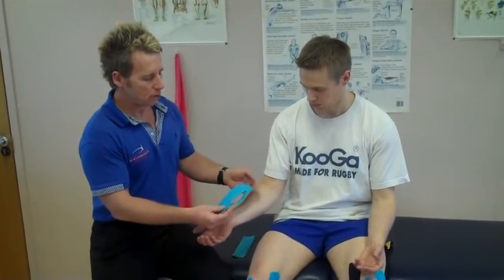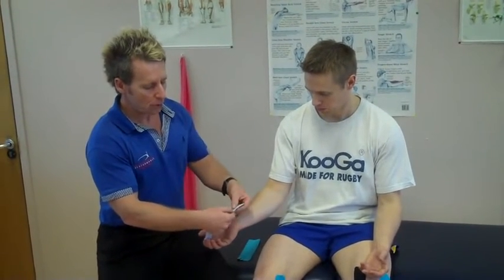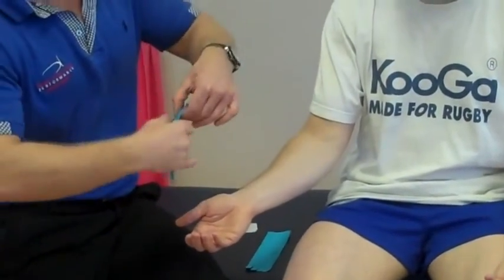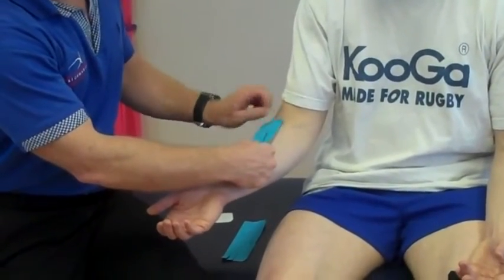We've got two prepared strips that I've just cut into a fan shape, and if we turn it over we can literally just split them so we've got the legs exposed. Then we apply the base of the tape where the lymphatic nodes are located, so this is going to be placed towards them.